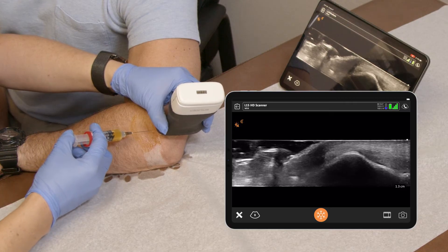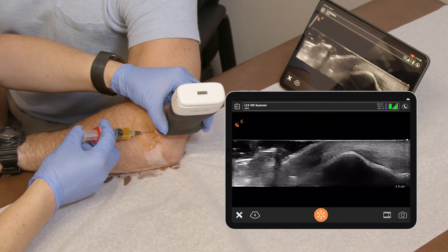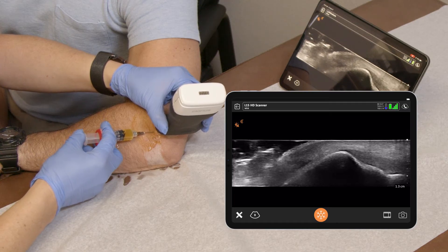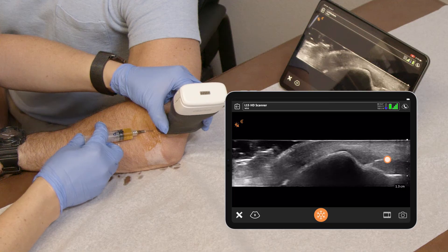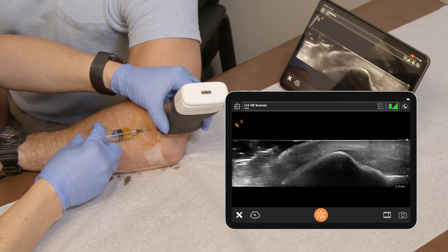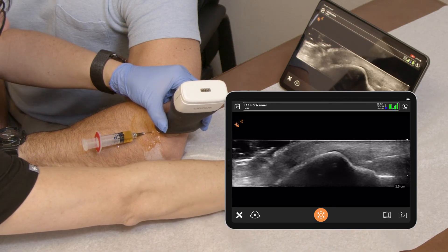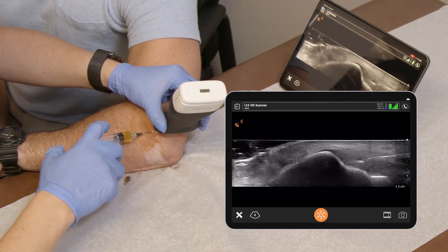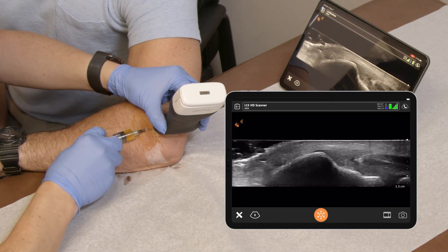Now I'm going to bring my needle in plane. And there's my needle — exactly where I want it, right at the epicondyle — and I'm injecting now. We can see nicely into the area, and we're injecting into the whole region.